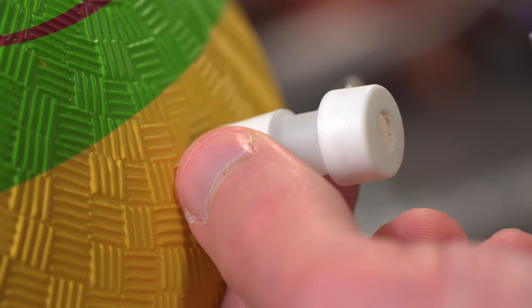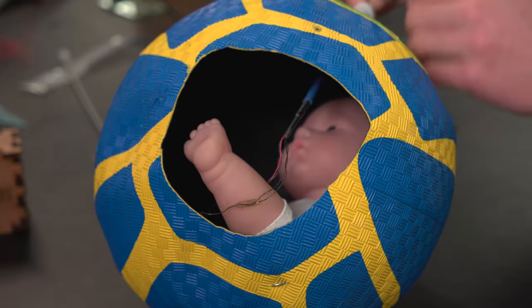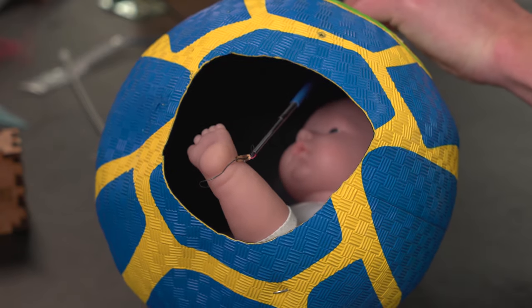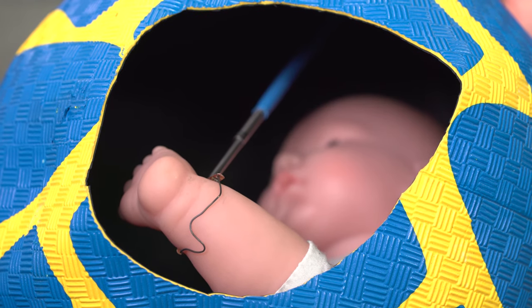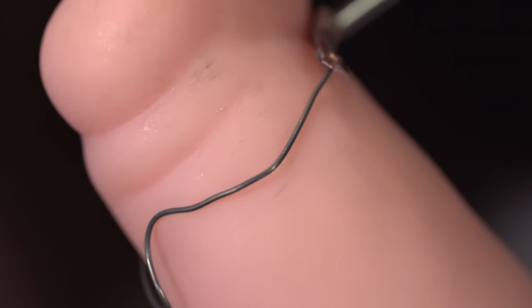So our device passes through this port, and then once in the womb, the nitinol reinforcement of our device expands into a loop, and the surgeon can then wrap the device around the fetal extremity and tighten it in order to monitor the fetus's blood oxygen.